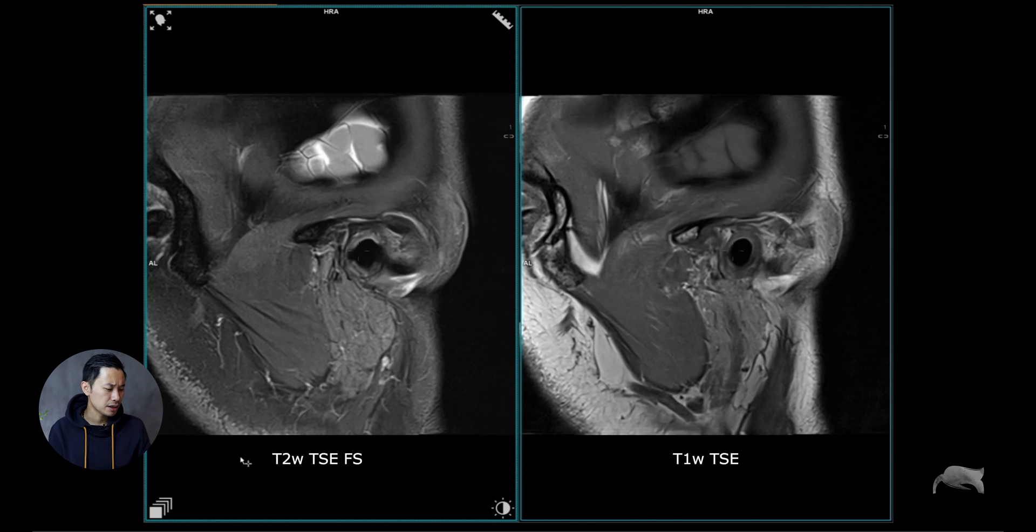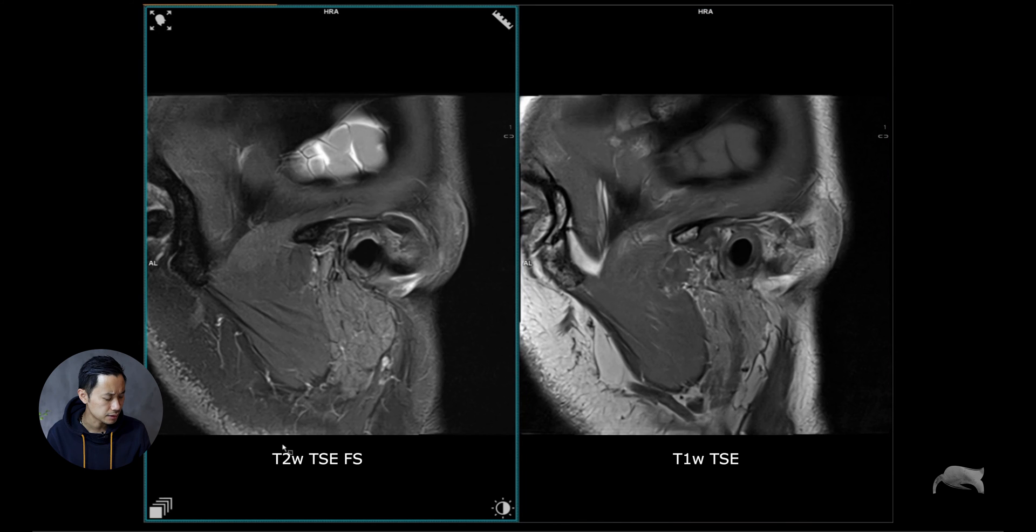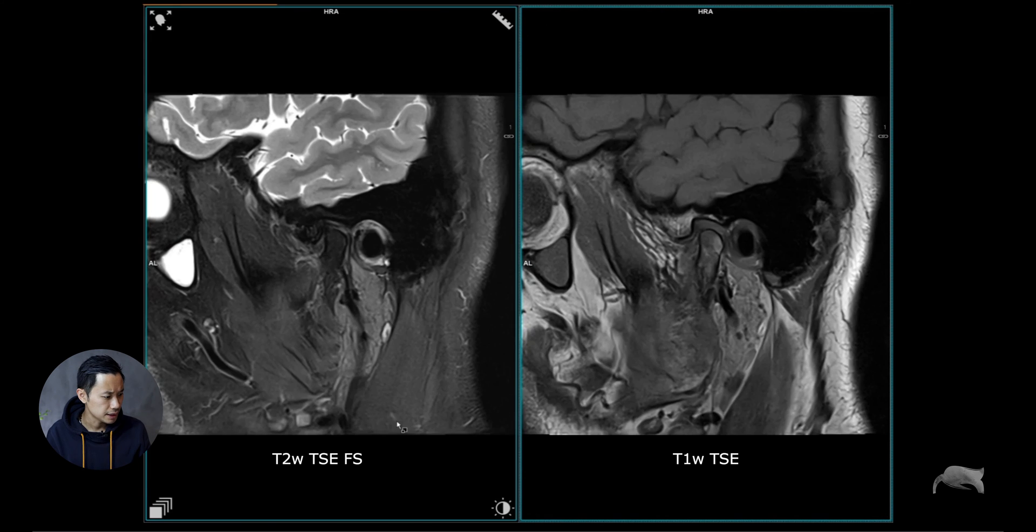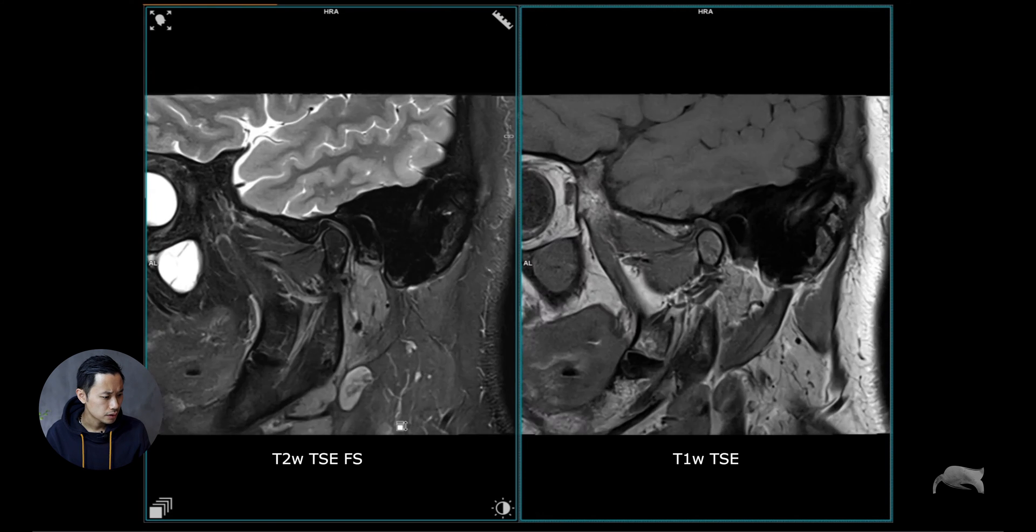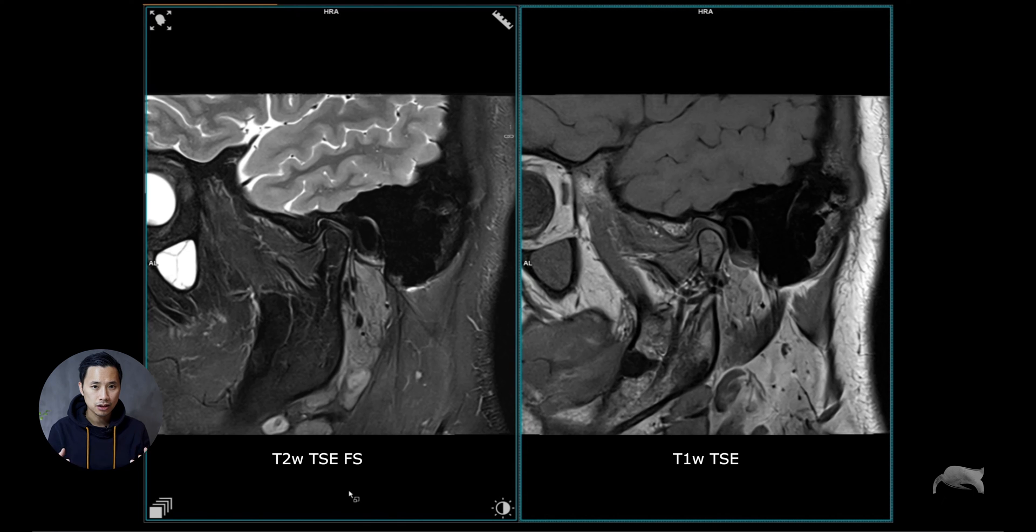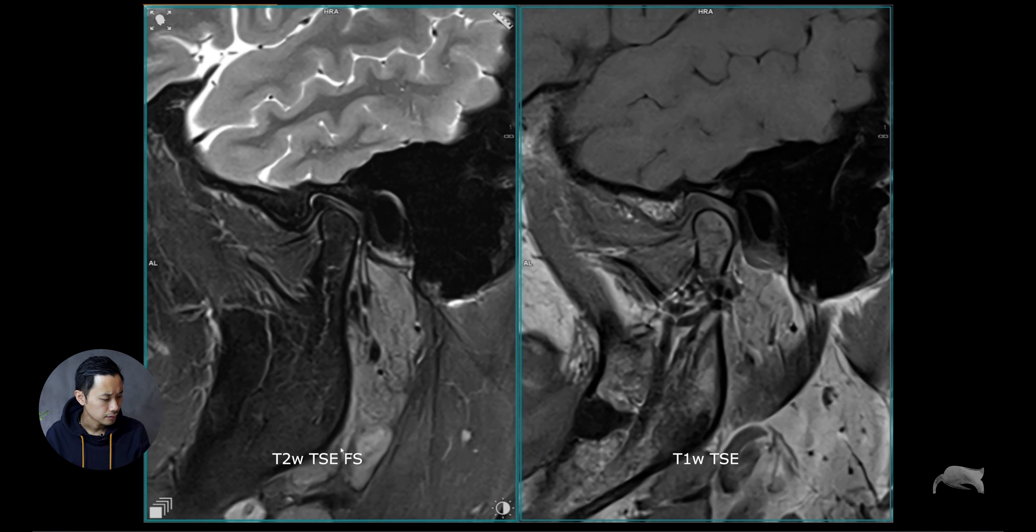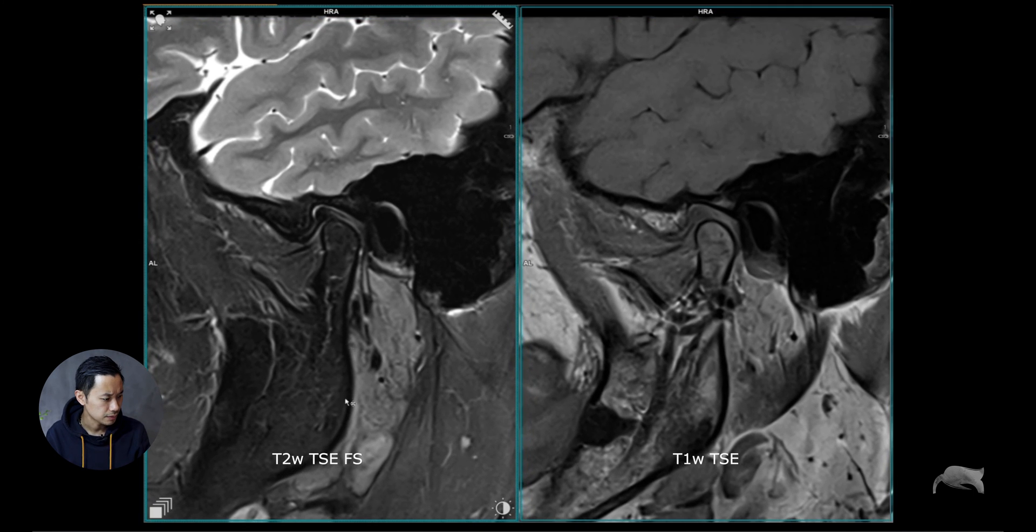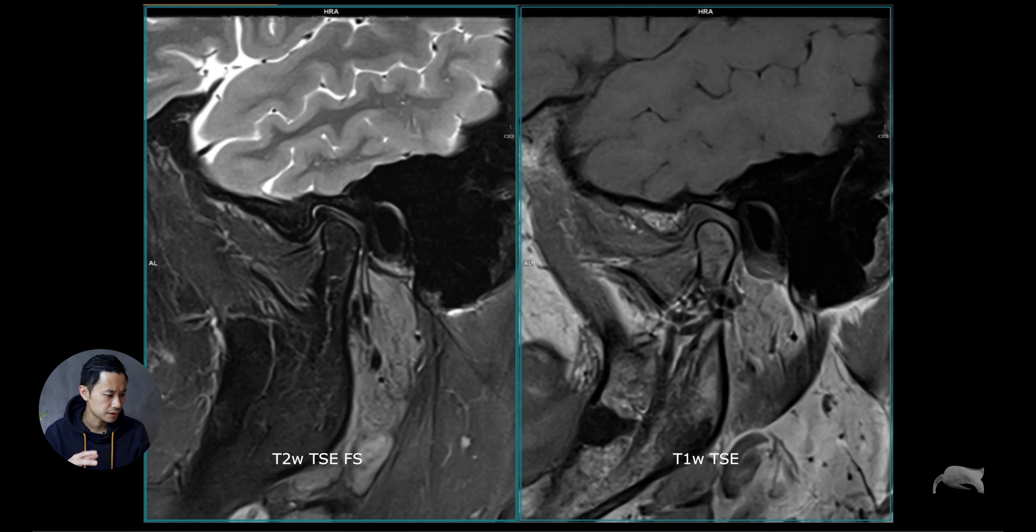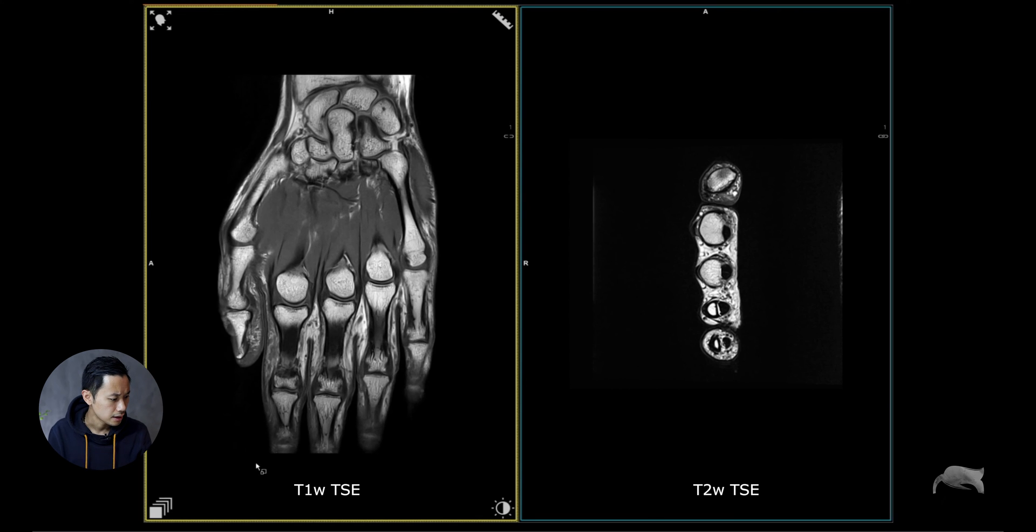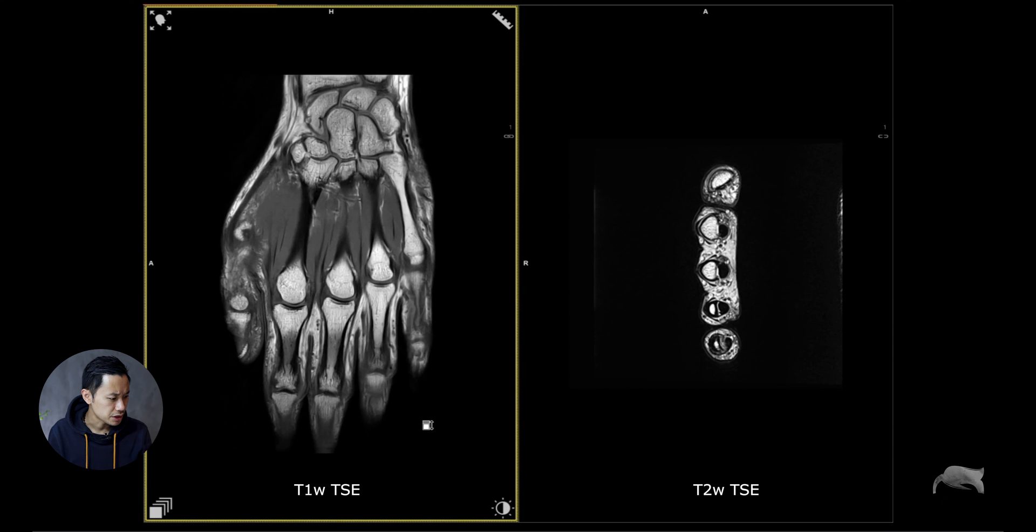This is the TMJ—just did two scans here with the Ultraflex. It's a very good coil and easy to use, just wrapping around the patient, the large 18 channel Ultraflex.